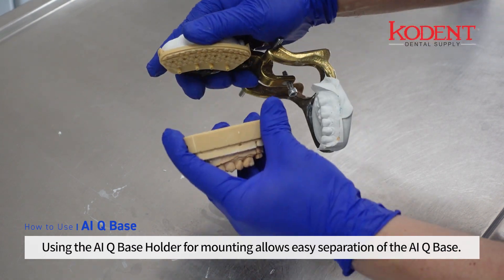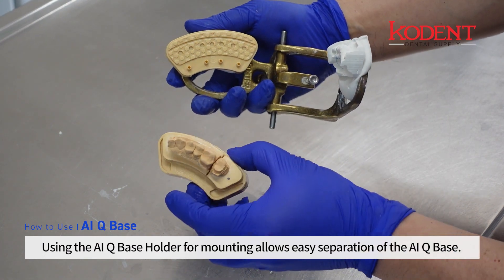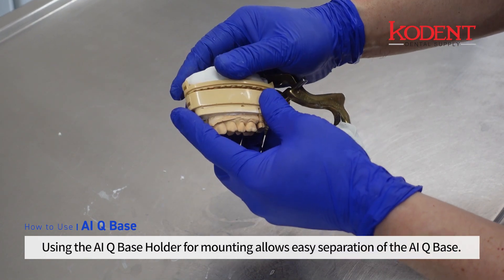Using the AIQ base holder for mounting allows easy separation of the AIQ base.